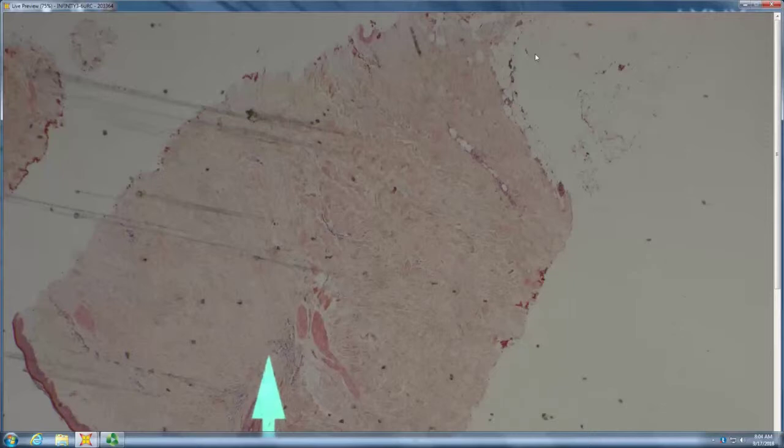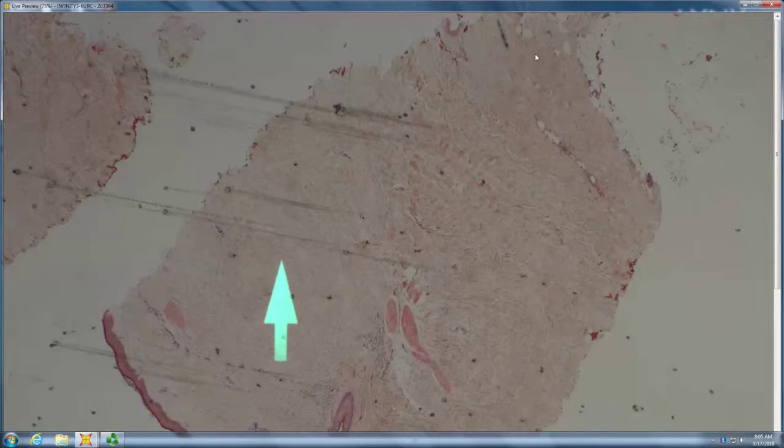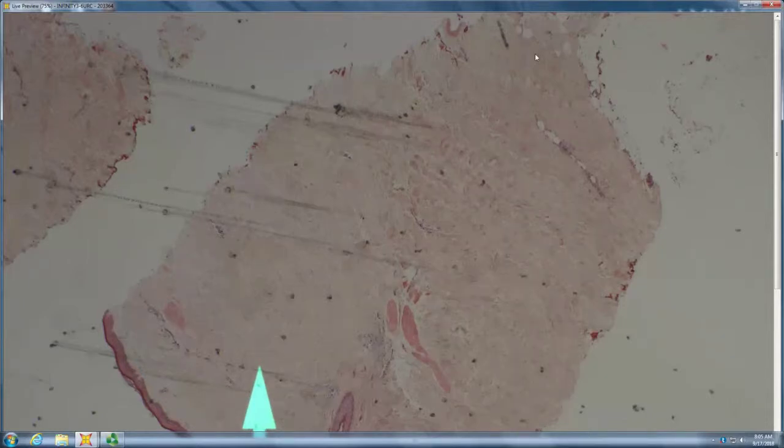There's a hair follicle that's preserved. There are other arrector pili that are orphaned. Tell me about the amount of space between your collagens. It looks pretty decreased, making you think of it could be scarring. Do you see an increased number of nuclei like a scar? No, could be morphea. Anything you might want to do for confirmation? We could get a CD34.